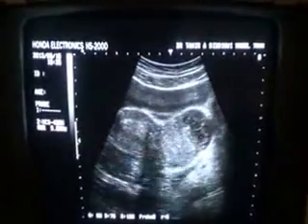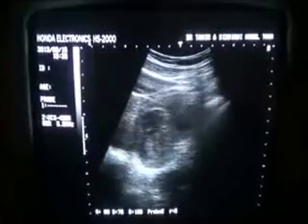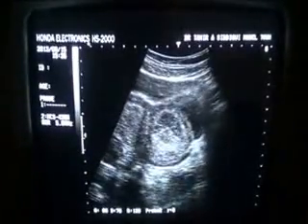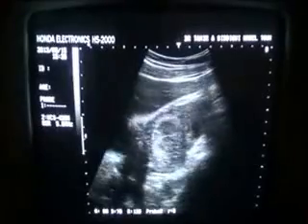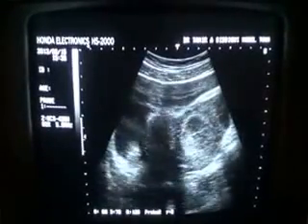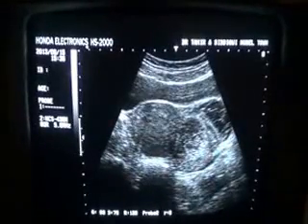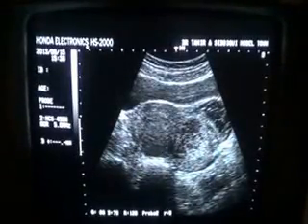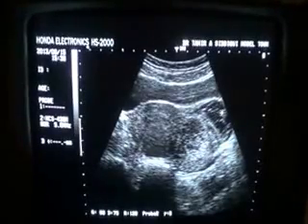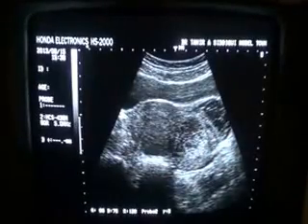Now what important information that we can give to this patient is that if this tube is removed surgically, as it has been badly damaged by the collection of material that is an abscess, you can see fine, thin septa, fine septations, thick echoes, low-level echoes.